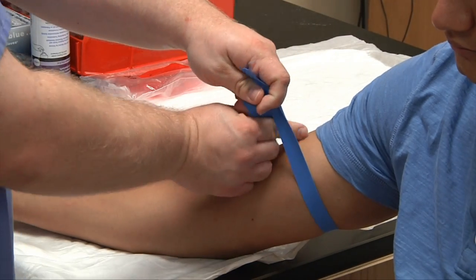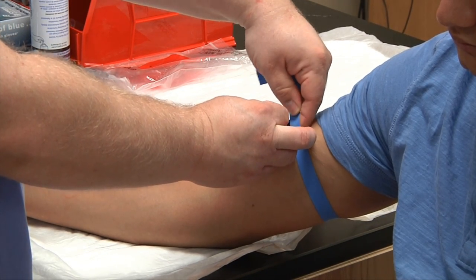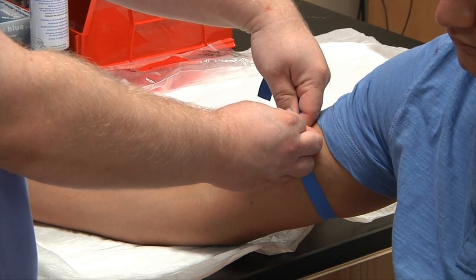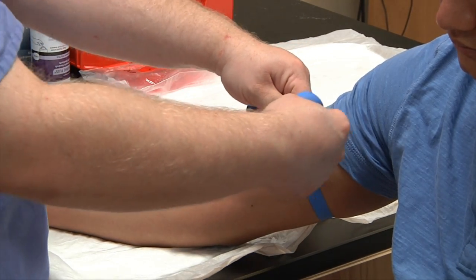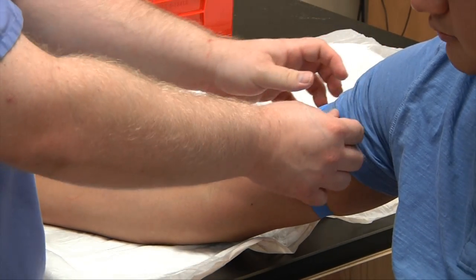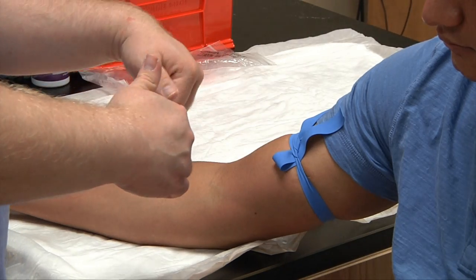With my non-dominant hand, I position the strap on the backside and give it a pull. I place my pointer finger of my non-dominant hand underneath the tourniquet, pull with my dominant hand, and tuck under — leaving a little tab to release the tourniquet. Remember: we always want bunny ears up, not frog legs down.